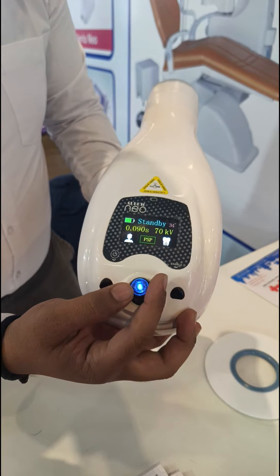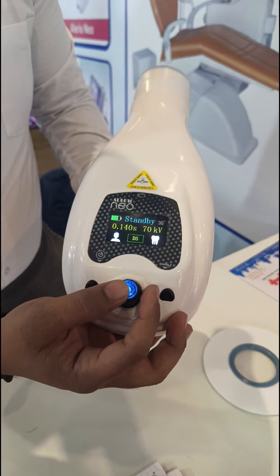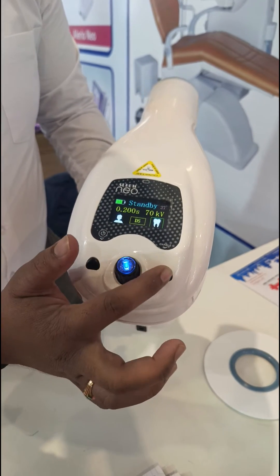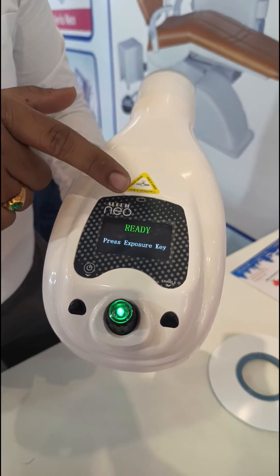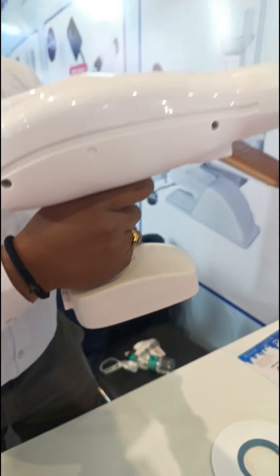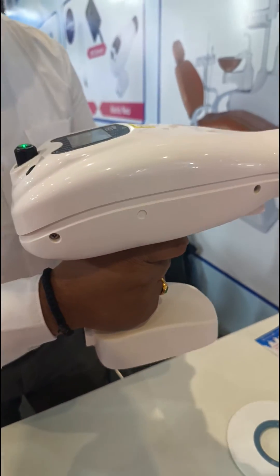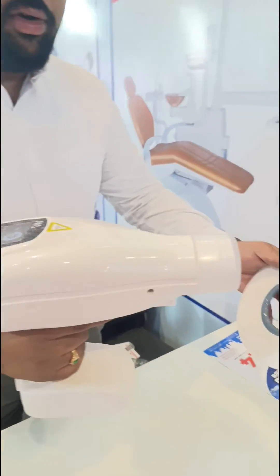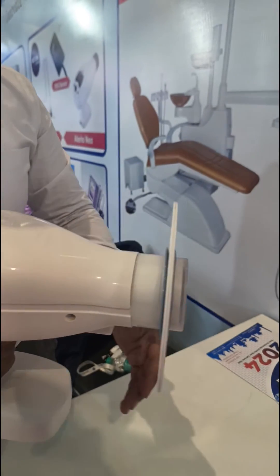You can select between adult and pedo options, and choose from PSP, film, or digital sensor modes. After selecting all settings, you have an enable switch — once you enable it, the X-ray starts preparing and will be ready. Then use the trigger switch to shoot; press and hold the trigger switch until you hear the beep sound.